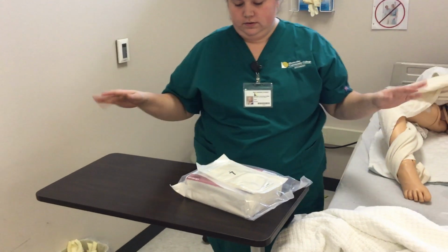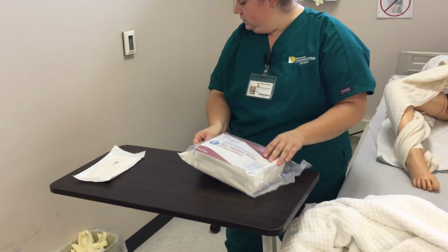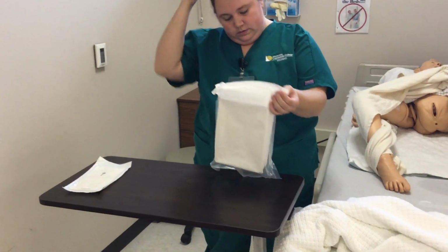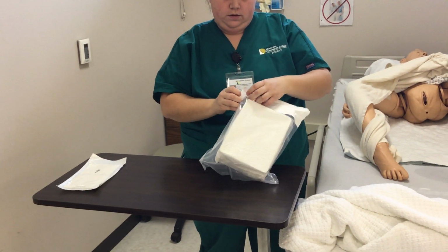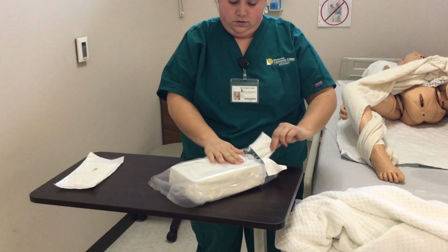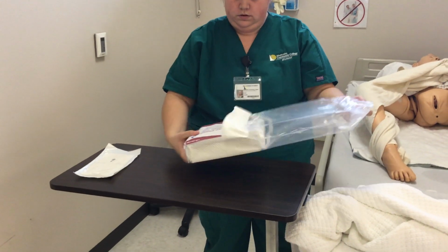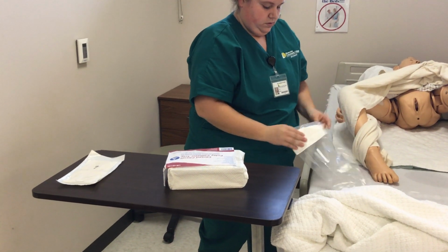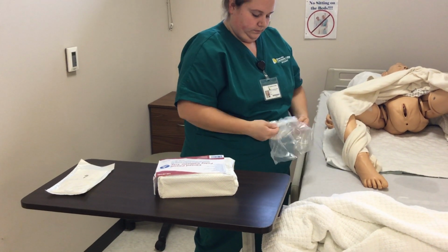We're going to come into the room. We check name and date of birth, looking at their name tag, and raise the bed up to the right level. Then we're going to ask the patient if they have any allergies, and we're going to assess the patient's weight, cognitive level, mental health, and also their mobility. We're also going to ask the patient if they've ever had catheters before, and if so, if they have any feelings about the procedure.